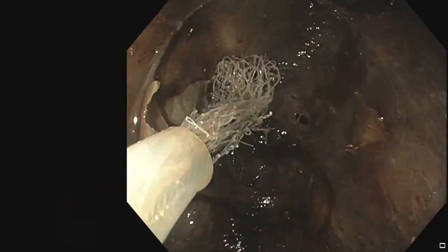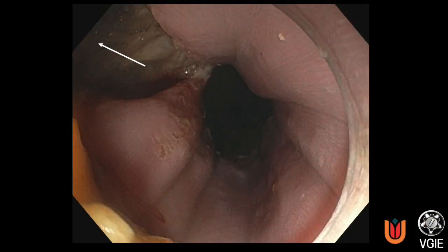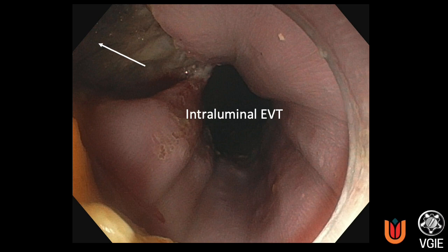After cleaning of the cavity, an attempt was made to place an esosponge into the cavity. However, due to the sharp angle upwards, this was not possible. Therefore, an esosponge was placed in the esophageal lumen, covering the defect.